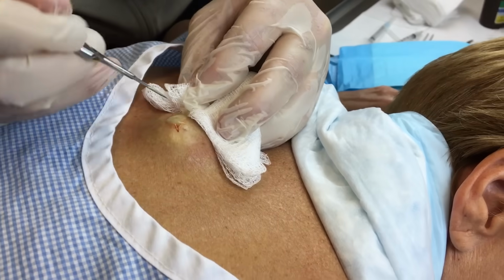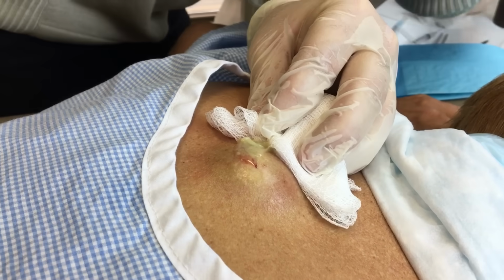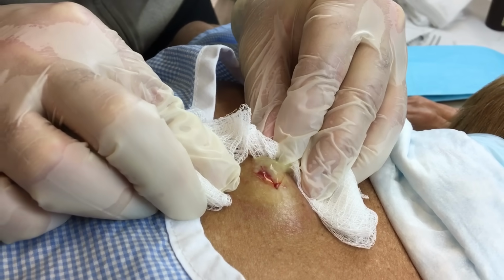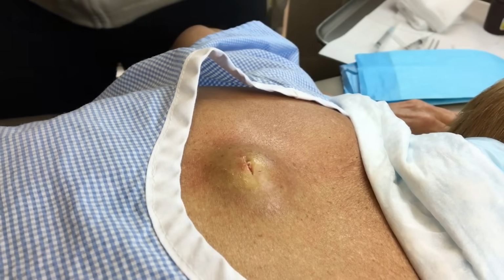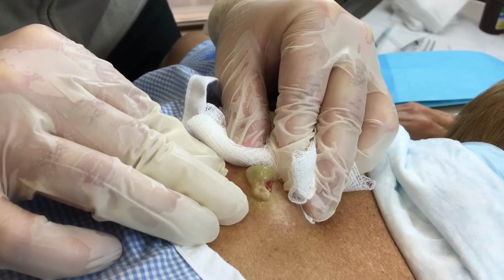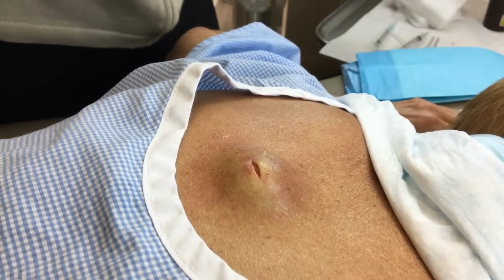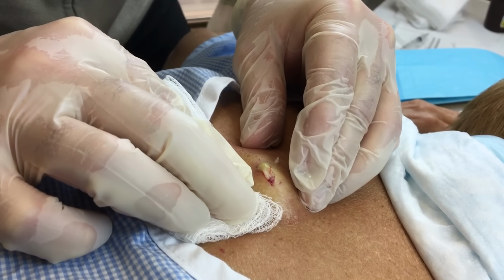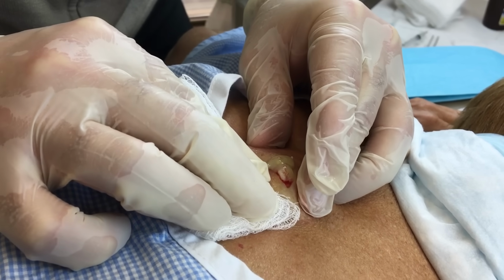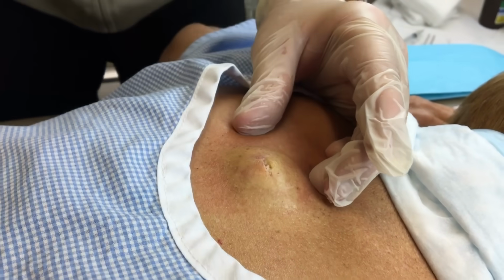So you notice with the blade, I start to use an angled approach. So I use the blade to break down some basic adhesions. And I can't stress enough, you should have lots of 4x4 around. So I start to see some pressure. And you try and find a balance between putting a little bit of pressure so you can get this to drain without causing a big mess. And this one's a big one, so it's a balance between pressure and... you okay? Mm-hmm.